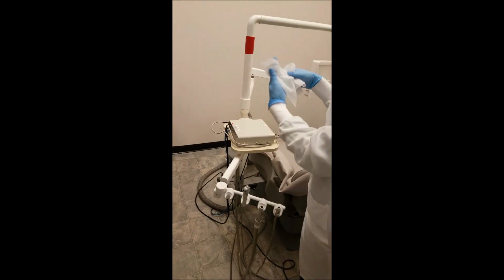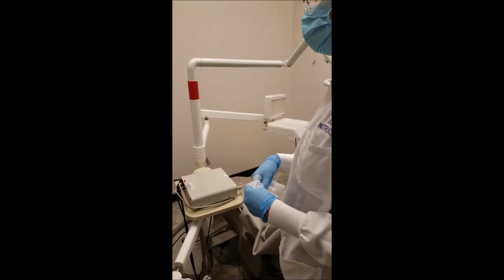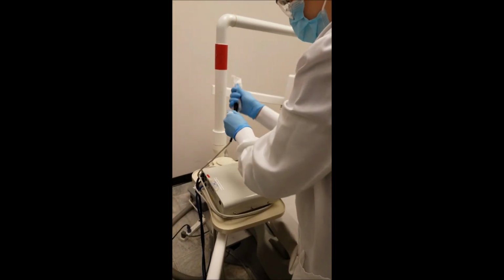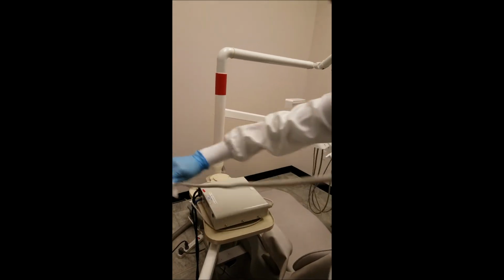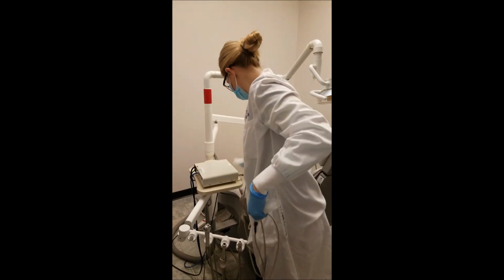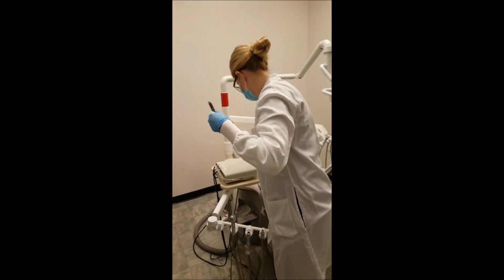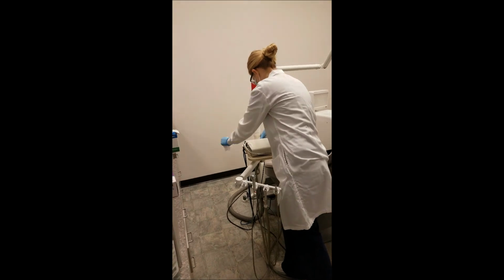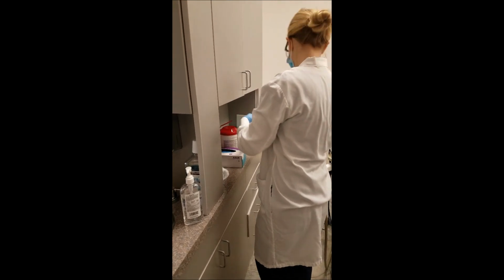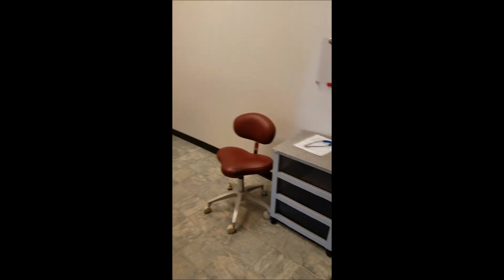Okay? And then she will wipe down the ultrasonic, including the handle and the tubing. Oh my goodness. Okay, now she will wipe down the ultrasonic, including the handles and tubing. And then she will obtain 2 new wipes, 1 in each hand, and will carefully disinfect the rolling cart.